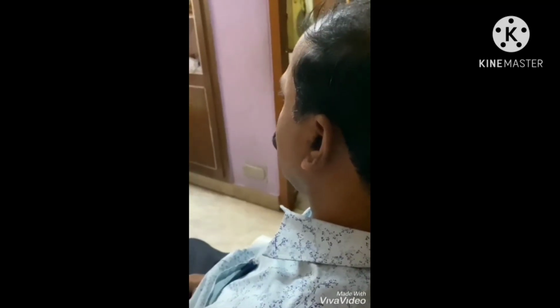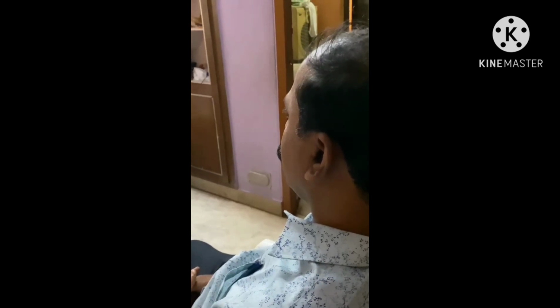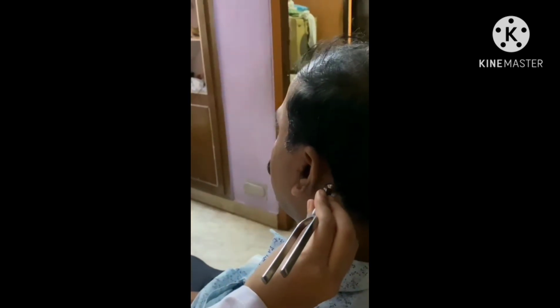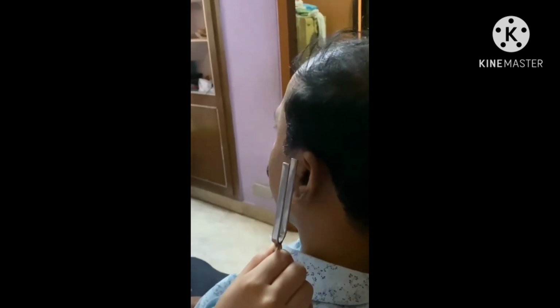Now, compare bone and air conduction by performing the Rinne test. Usually, air conduction is greater than bone conduction. Place the vibrating tuning fork on the mastoid process behind the ear and ask the patient as follows. Tell me when you no longer hear any sound. I can't hear. Can you hear now? Yes.